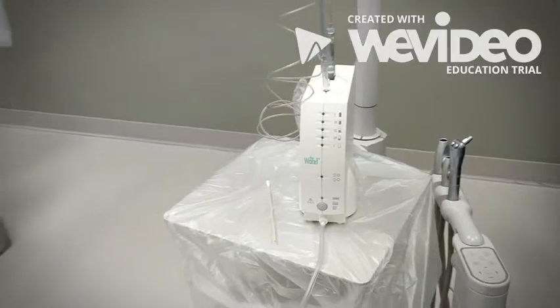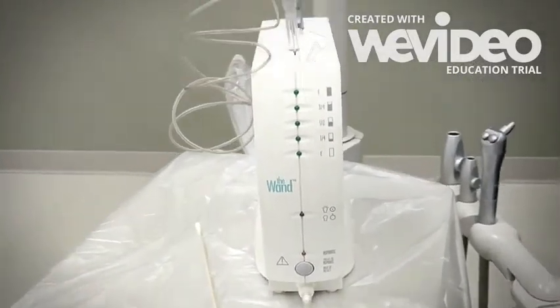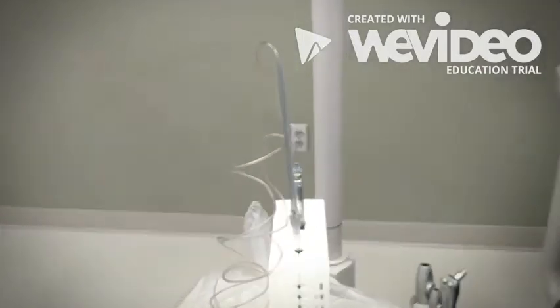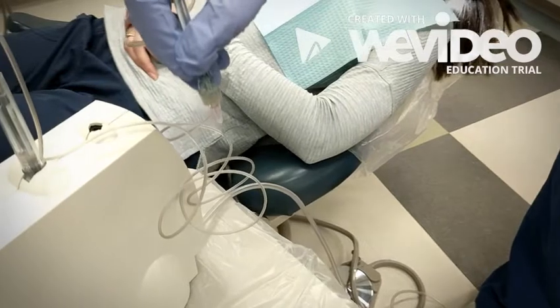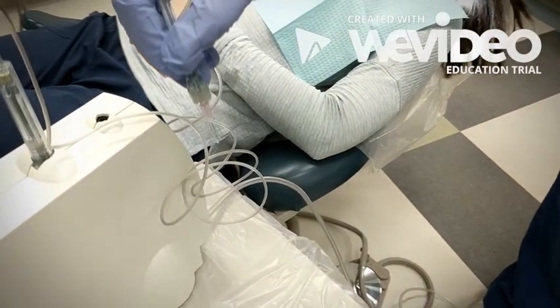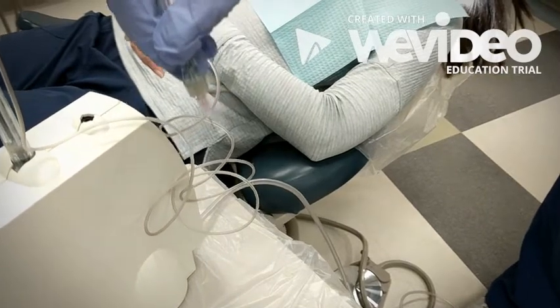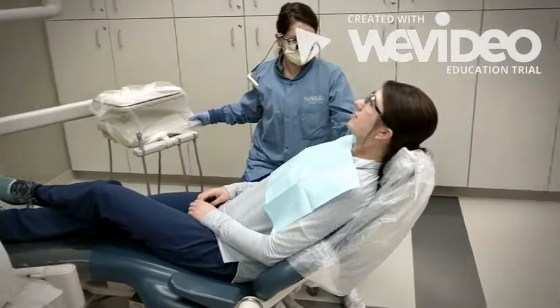The wand was developed in 1997 by Milestone Scientific. What makes it unique is that it's a computer-controlled local anesthetic delivery system. Because of this, it has changed the way patients view dental injections. Currently, only half of the 52 dental schools throughout the country utilize this technology. However, many dental offices have switched to using this anesthetic delivery system. Thus, it is imperative dental hygienists are familiar with this device.